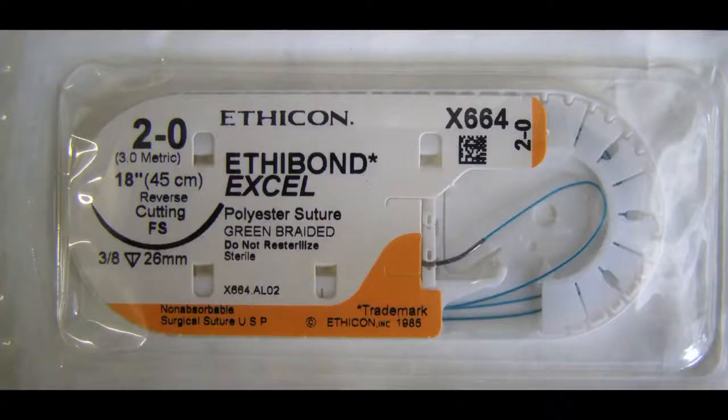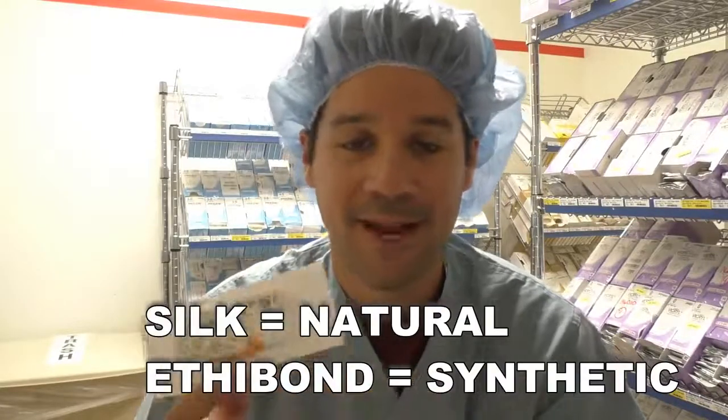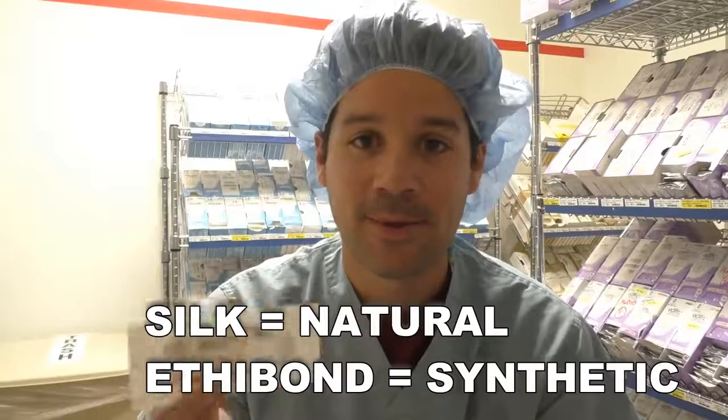The second suture I want to talk to you guys about, again multifilament, is the Ethibond. The Ethibond has the orange packaging, but the suture itself is green. Now, I see this as basically a green silk. It's very, very similar to a silk, except that it's green. They're both non-absorbable sutures, and they're used in many of the same ways.